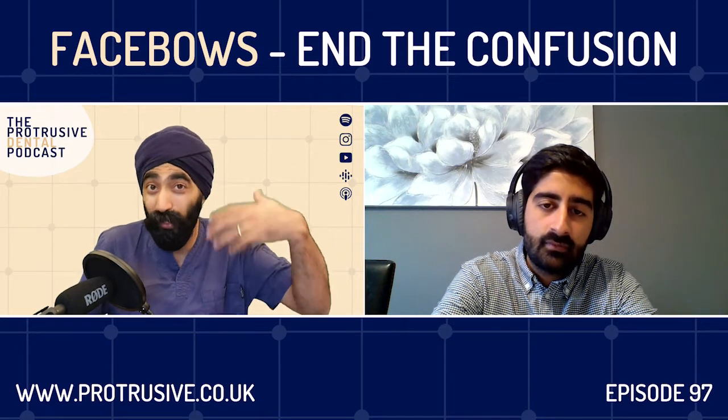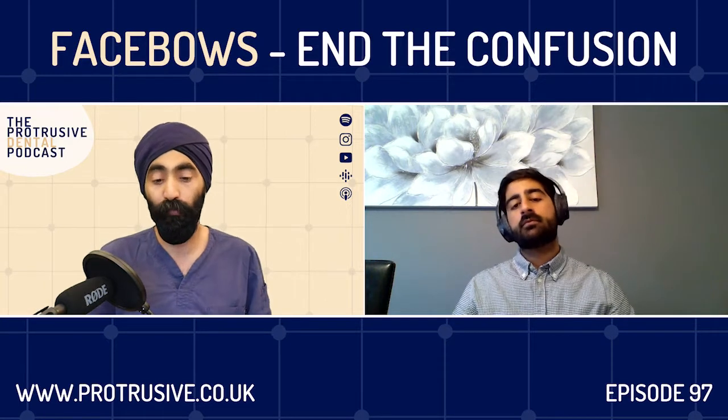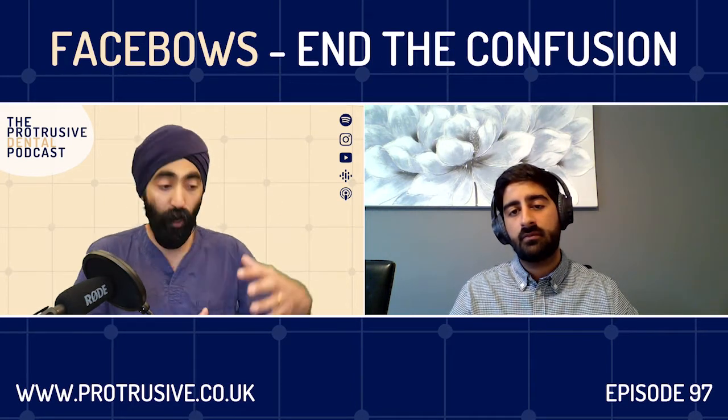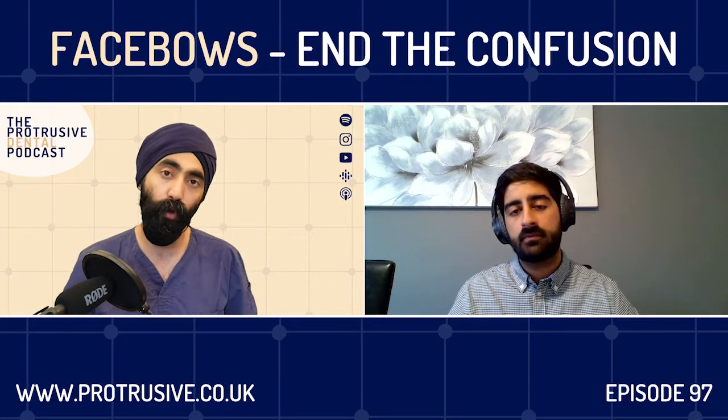Or just to know at the beginning that you might just need to prep a little bit more, and can your tooth handle that before you get to it. And then I've also done things like island prep before, and then various techniques. But yeah, you're right. Having a Facebow on that can help you to visualize the challenges. What about you? Anything you wanted to add to that?